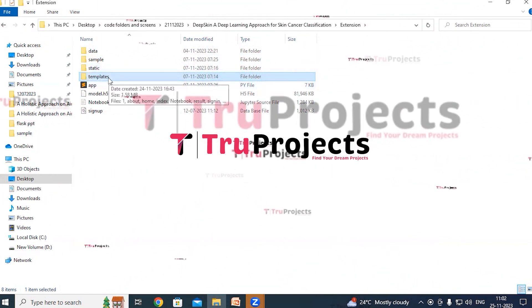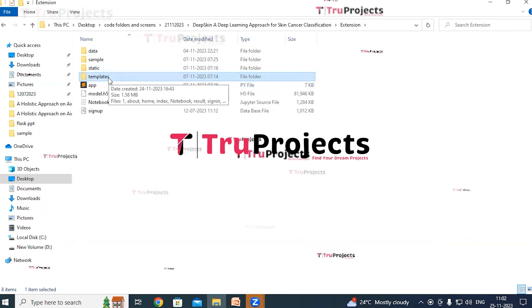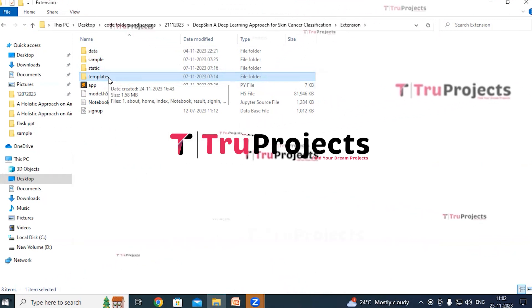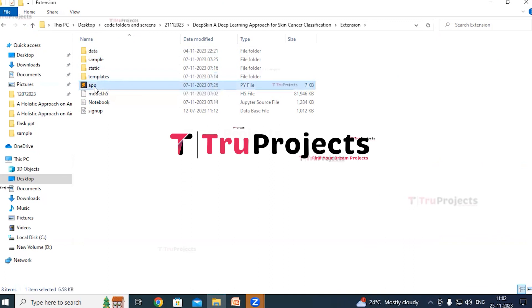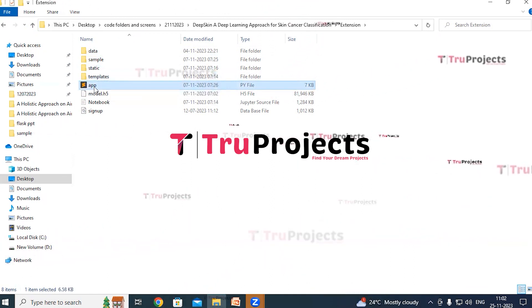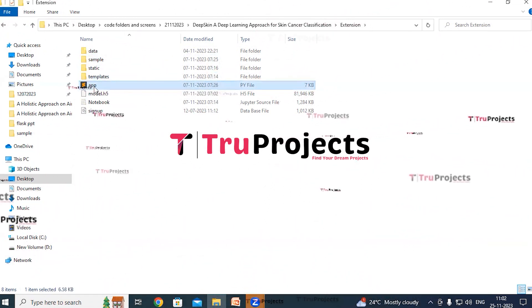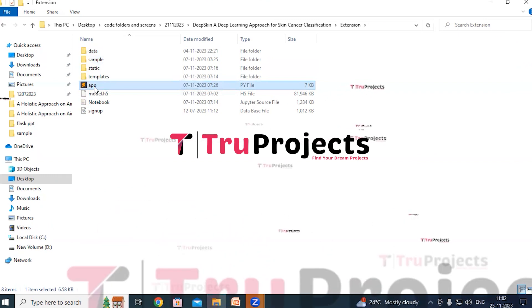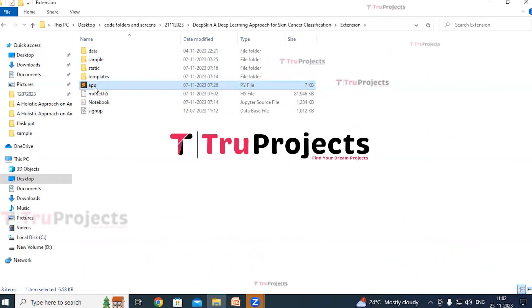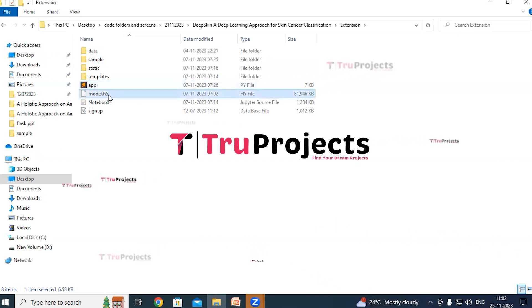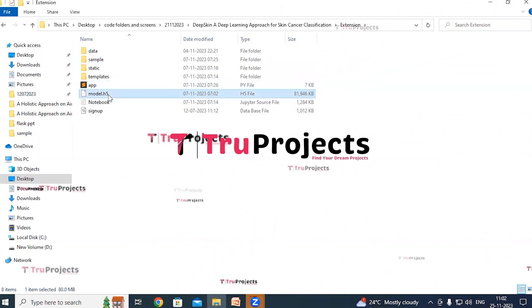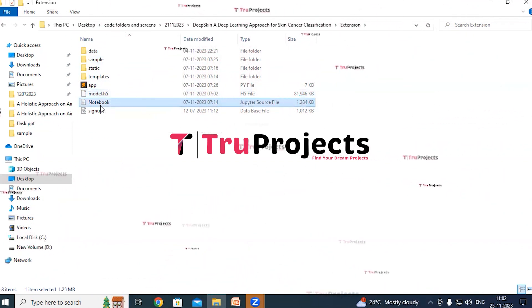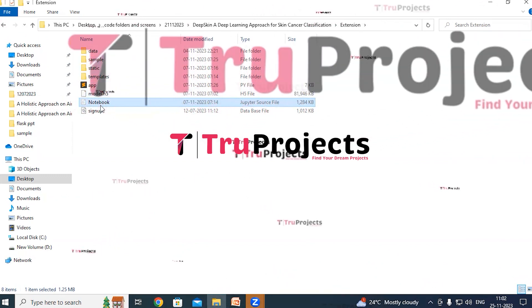The templates folder contains all the HTML pages used in the project, including files like index.html and about.html representing different pages of the website. The app.py file contains front-end logic, with Python code handling server-side operations such as processing user requests, interacting with the database, and generating dynamic content for HTML pages. The model file contains algorithm information loaded into the project during runtime.